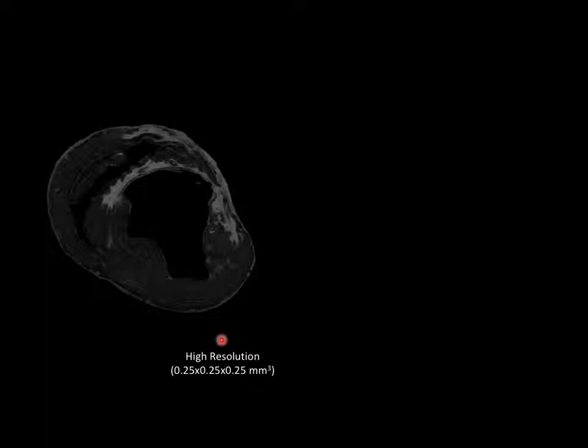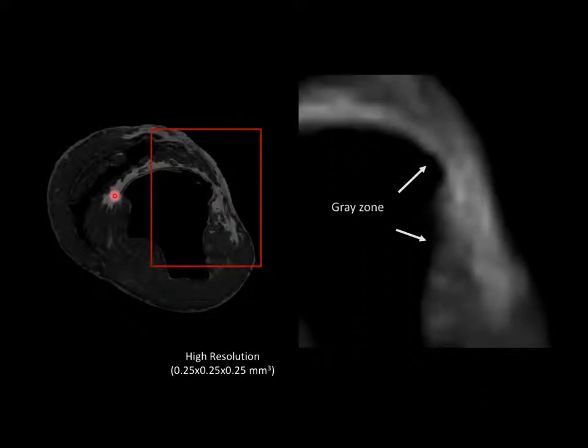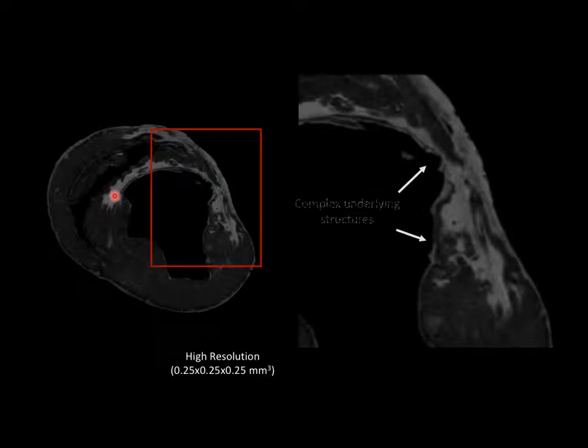That's when you image the thing in a jar for an hour and a half, such that your voxels are now 250 by 250 by 250 microns. So sort of CT style resolution. So it's quite extraordinary, the difference between what you see on a clinical image and what's actually under there, in terms of the details of the normal tissue that's interdigitated inside that infarct. And if we zoom that up, here it is in clinical resolution, right? And that's what's actually under there.